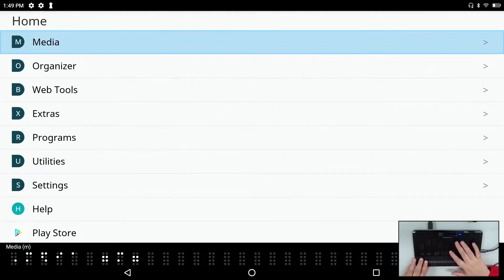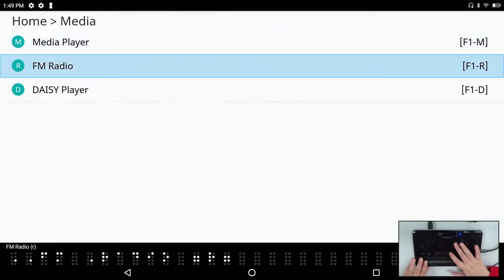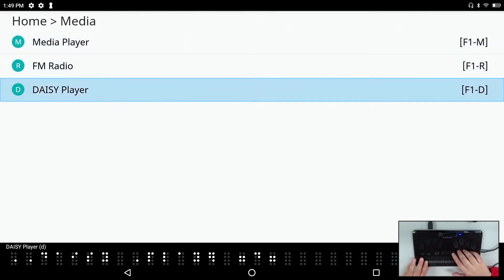We have our media menu, which includes the media player, FM radio, and Daisy player.